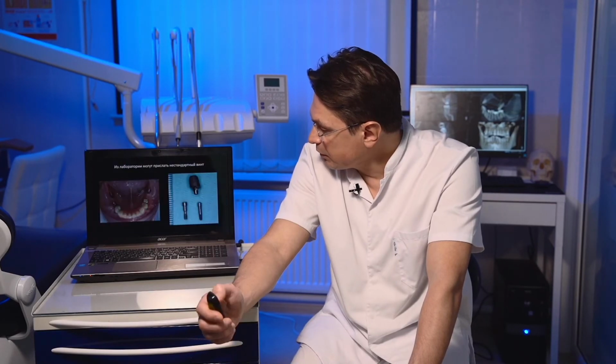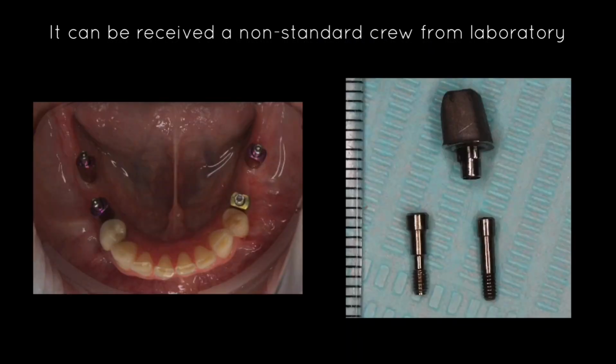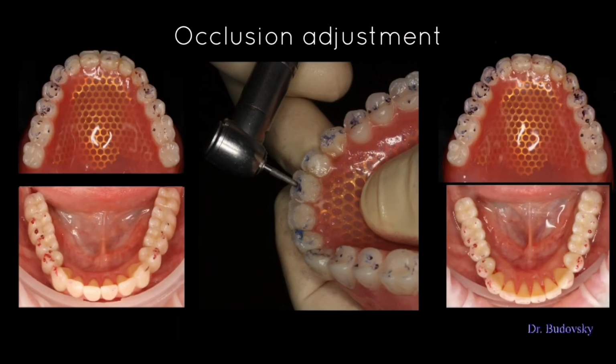Register, set up the teeth, we fix the crowns on the lower front teeth. Having already on the upper jaw a completely precise removable denture that will be permanent for the patient, now we can proceed to prosthetics of the lower incisors, and not just the posterior teeth. We manufacture and install it all in the oral cavity.